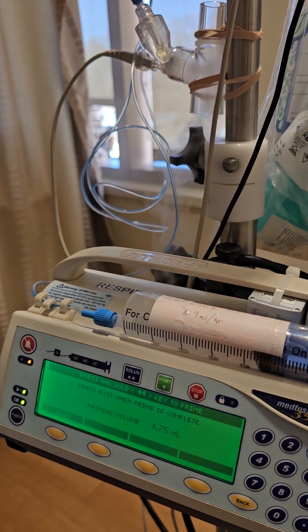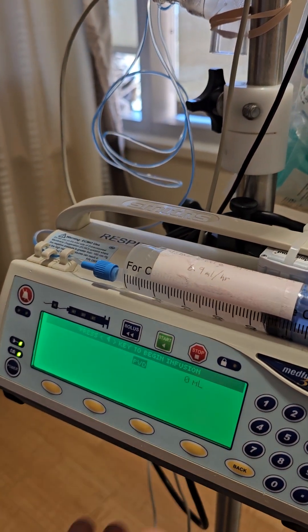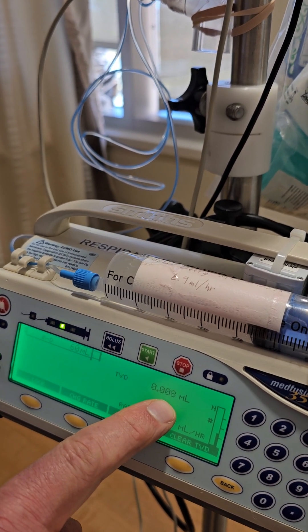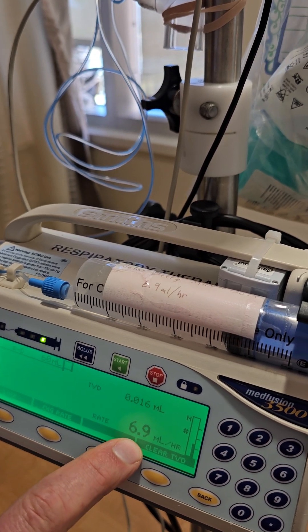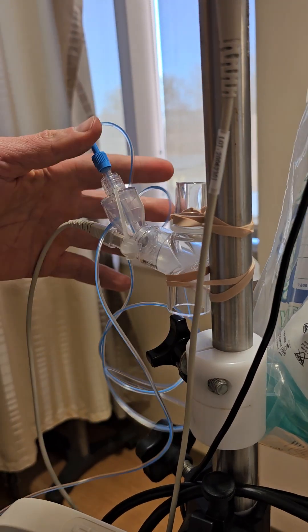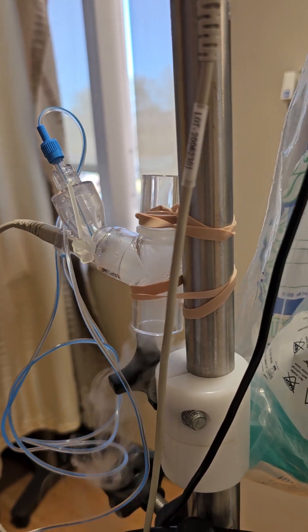We want to start our Flolan. We'll press the start button and we should see these lights flashing right here. We can see how much has been delivered in this spot, which confirms the rate per hour. We want to be sure that we see mist in the Aerogen nebulizer before we walk away from the patient.